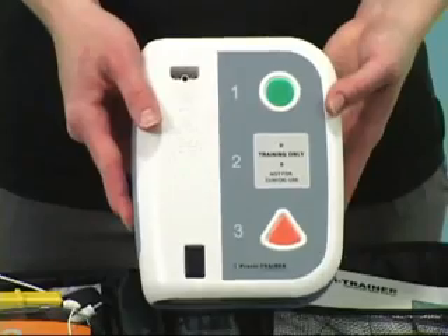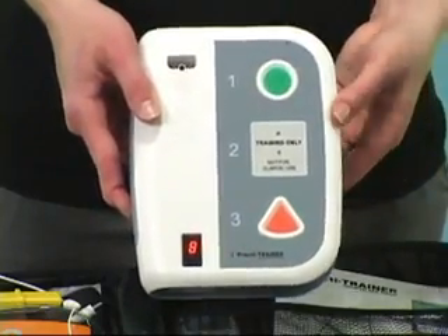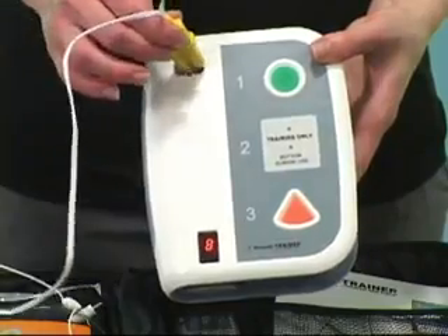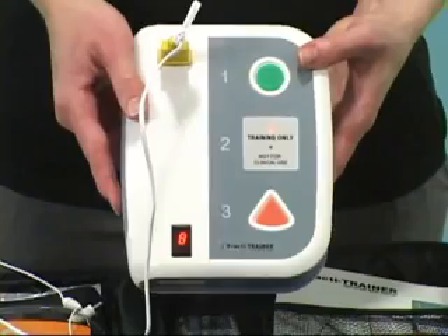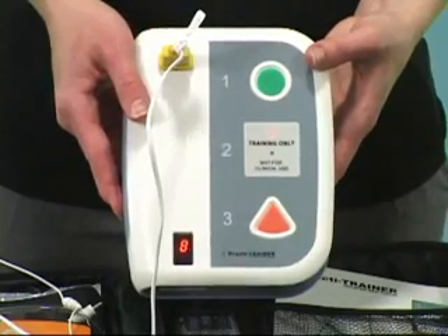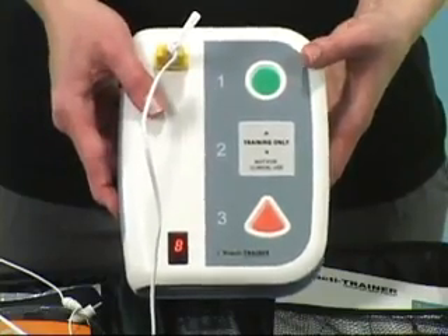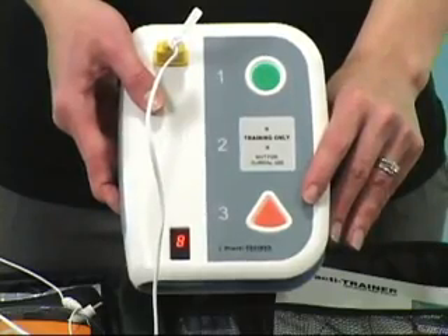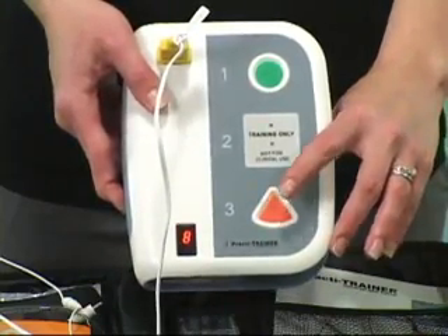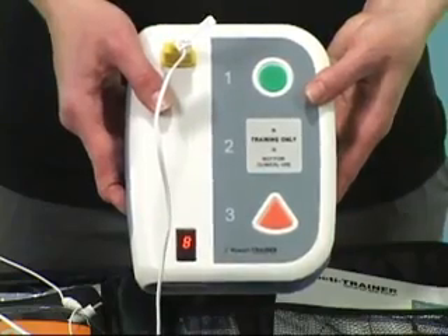Press the green button on the front and then just follow the prompts. The device will instruct you: 'Apply pads to patient's bare chest. Plug in pads connector. Analyzing heart rhythm. Do not touch the patient. Shock advised. Charging. Stay clear of patient. Deliver shock now. Press the orange button now.' Shock delivered. Begin CPR.